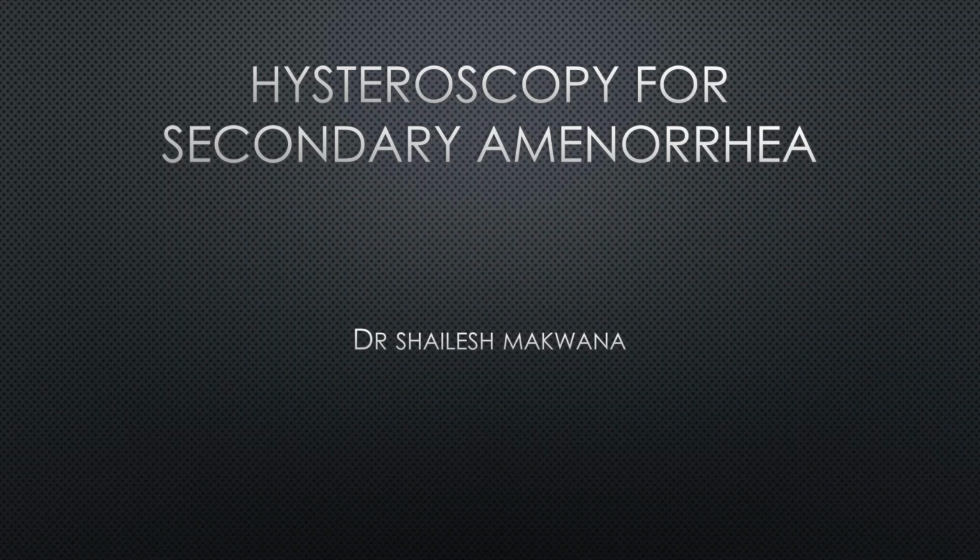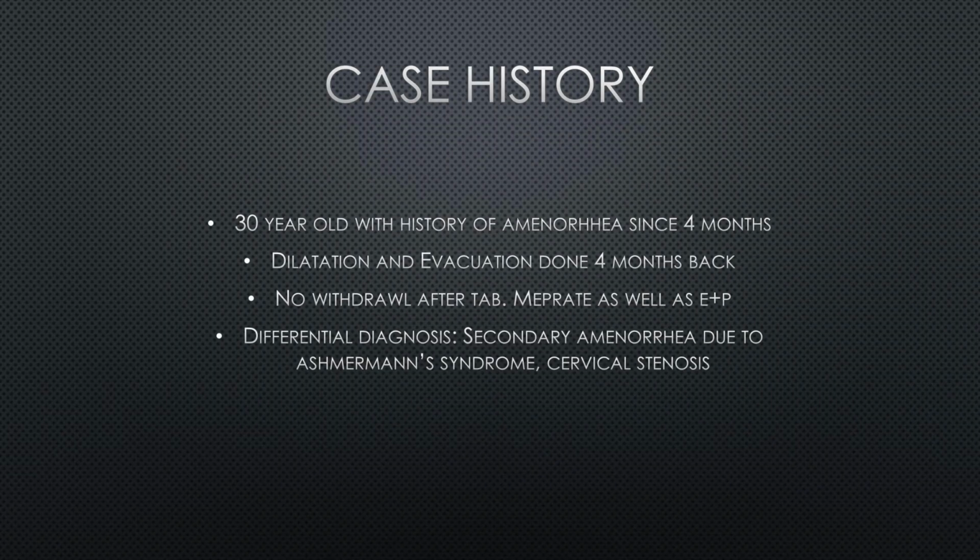Hello everyone, this is Dr. Sailesh Makwana with a case of hysteroscopy performed for secondary amenorrhea in a 30-year-old patient who failed to attain her menses after undergoing D&E 4 months before the procedure.